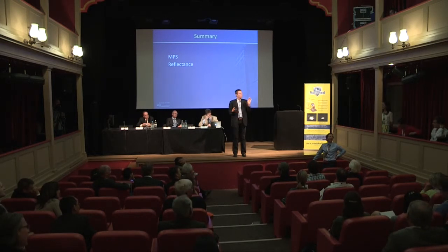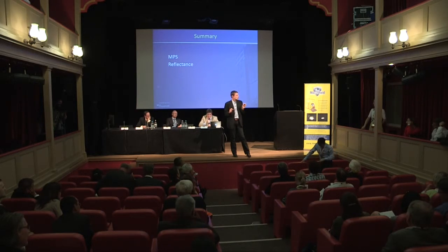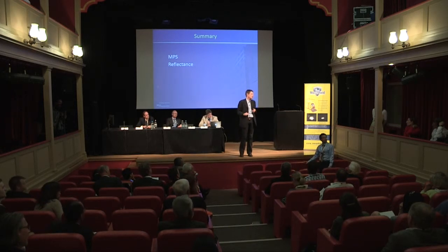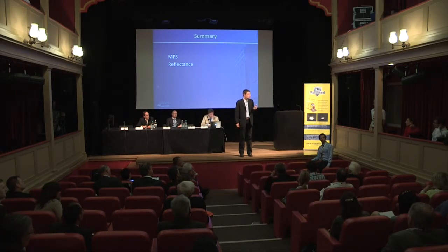No, I'm not in favor. Let me explain. Because we come up with actual measurements, we don't need a reference. You could also use the autofluorescence technique from Heidelberg or others, which gives you an actual distribution. But they also use some reference point at 7 or 8 degrees, so you end up with the same problem. Indeed, it may be that you have some changes at the peripheral, but I think that's because of the supplementation too. That's not an actual change in your, let's say, phi lambda curve, which would be the only cause.